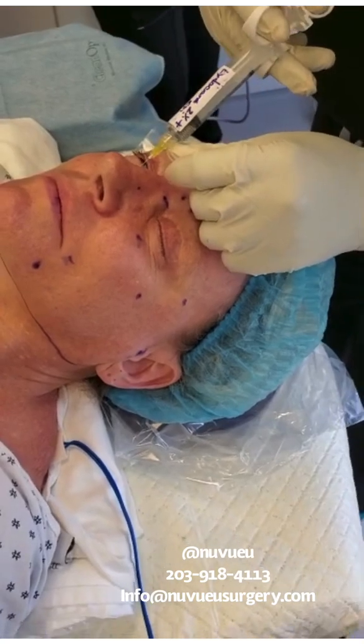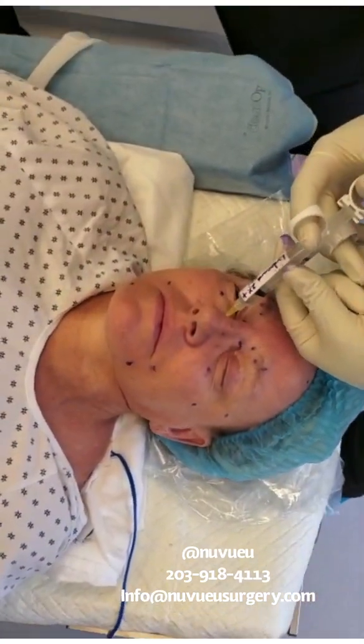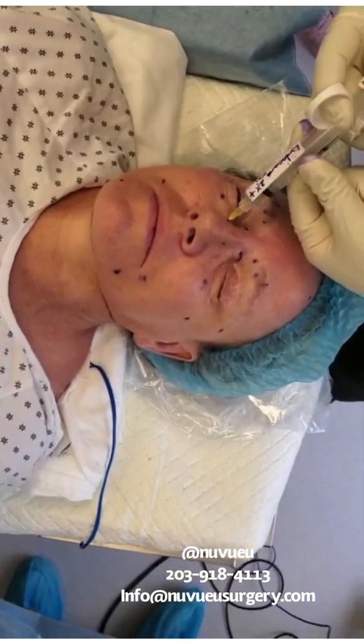So you want to block it. You're going to go down. Aspirate — make sure you're not in the vessel. And then you're in the correct position.